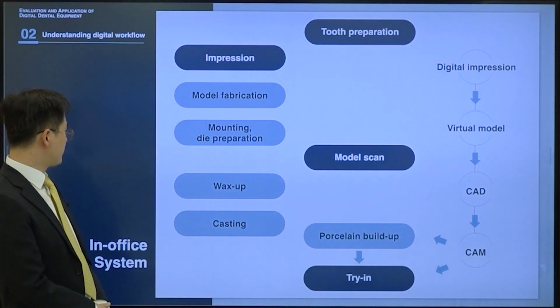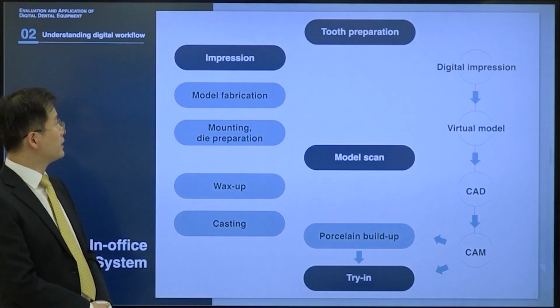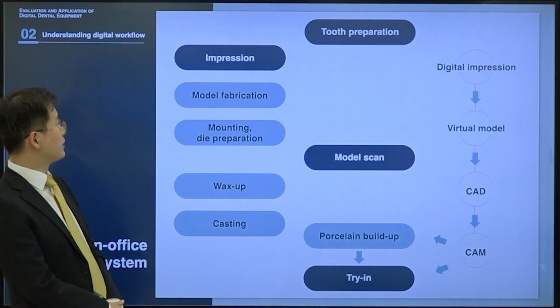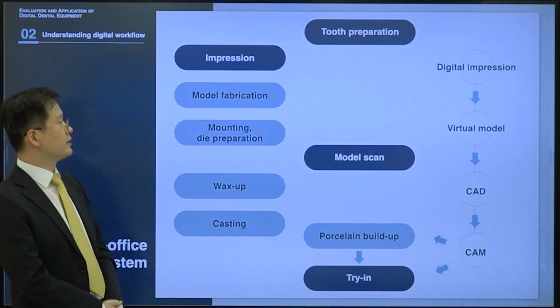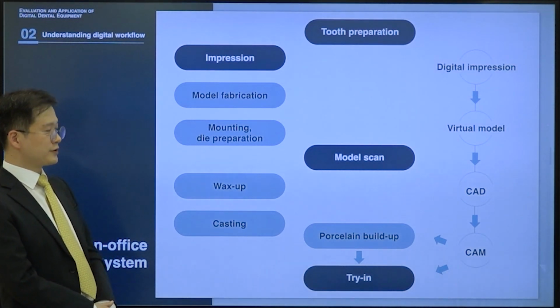But when we utilize digital dentistry, the workflow will be changed. After tooth preparation, instead of making an impression, we acquire a digital impression. We acquire digital images from various devices.